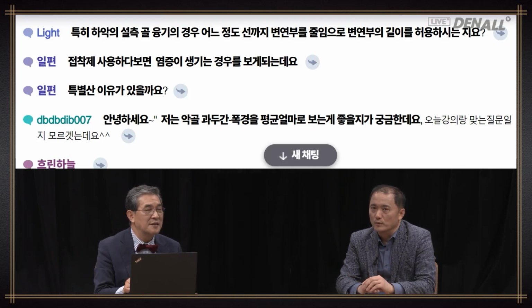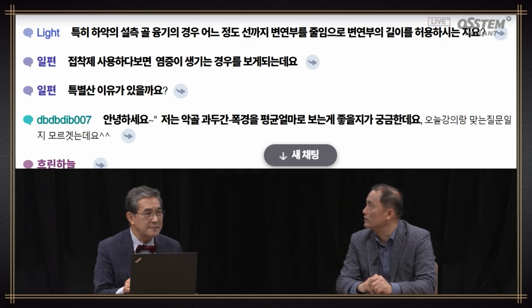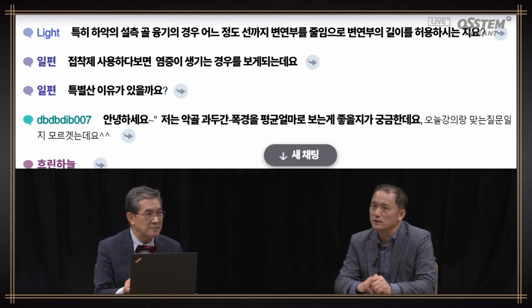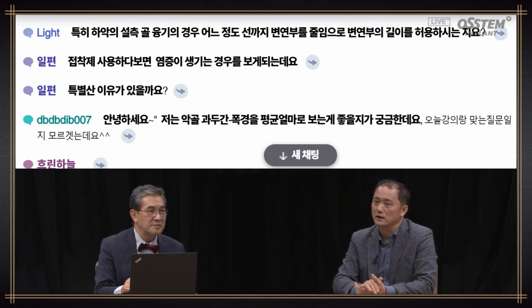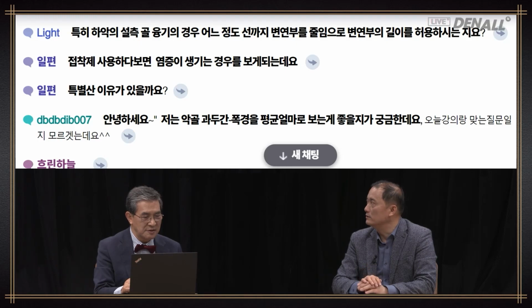Well, actually, if the mucosa is fibrotic and hard, then even with relief there's not much discomfort in that area. But if the torus is really big, or the remaining mucosa is not healthy, then it could act as a stimulus, and the denture could also move around left to right. So if there is an excess, it's better to cut it. Yes, it's better to cut.